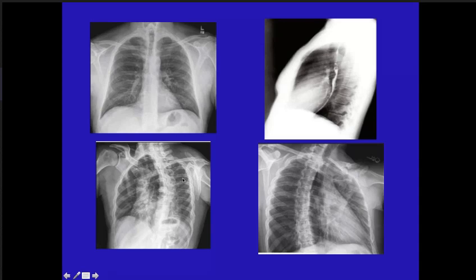You don't need to identify which ribs are in front and which are behind. All those things you don't need to identify. I'm only saying that they don't overlap like this. That's all you need to know. You make sure that they are not overlapping with each other.